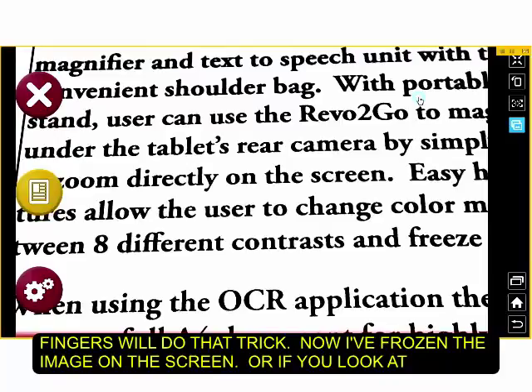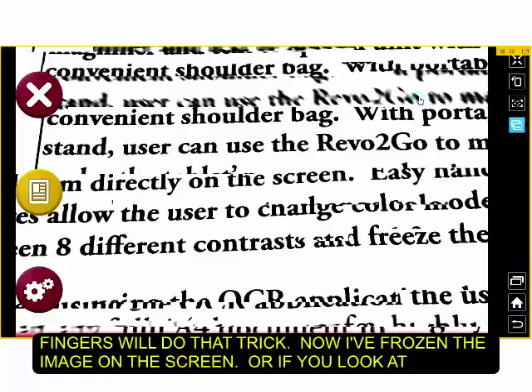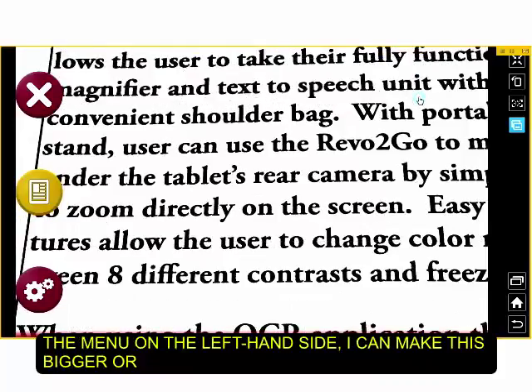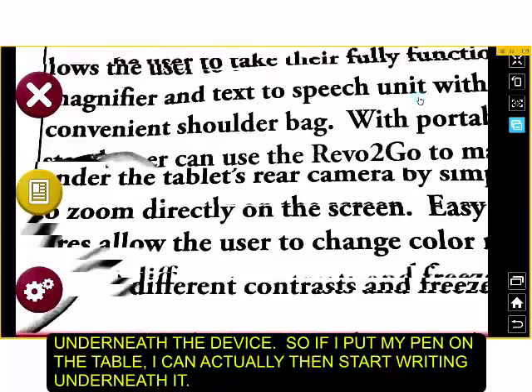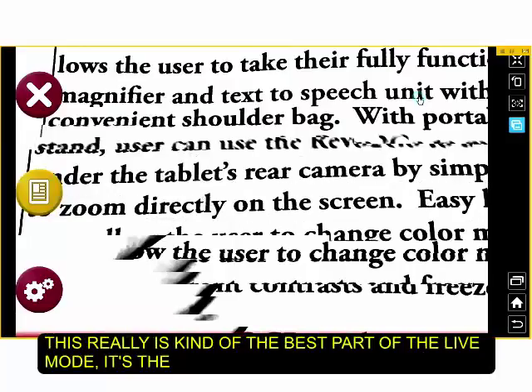So now I have frozen the image on the screen. Or if you see the menu on the left side, that center yellow button will also take a snapshot of it, and I can then manipulate it, make it bigger, change color modes and such like that. So that's kind of with the magnification. I can also write underneath the device. So if I put my pen on the table, I can actually then start writing underneath it.